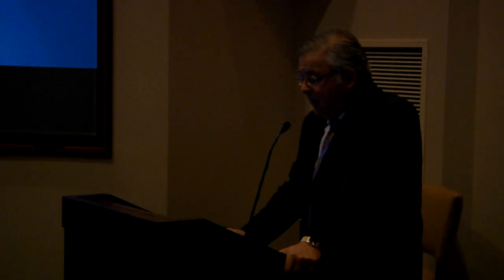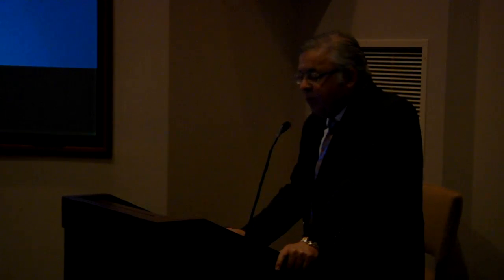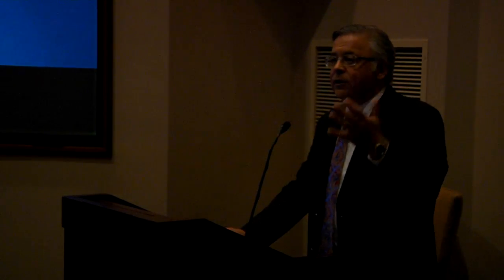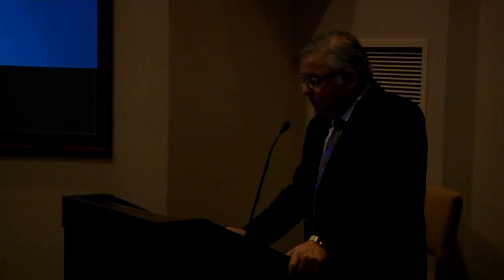There are shortcomings to any imaging modality. Dr. Claire Tempany from Brigham and Women's published a report in the journal Radiology in 2000. In that article, she illustrated not so much the instrumental limitations as the human limitations, because interpreting images is very much a human activity, and our performance is not perfect. In that study, she found that per patient, using either CT or MRI, our sensitivity was pretty good, but if you strip out the data and look at per lesion sensitivity, based on location, for example the subdiaphragmatic spaces and the bare area of the liver, and all of these difficult things that you probably don't think about routinely, either as a patient or as a primary care physician, then the numbers don't look so great.